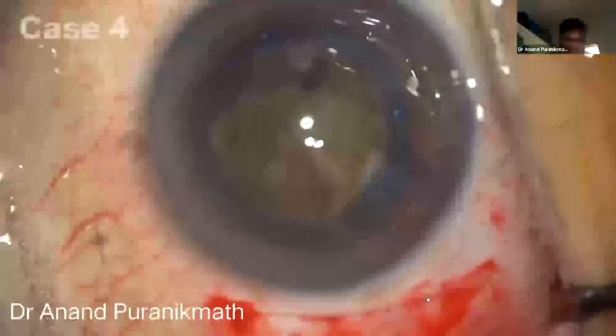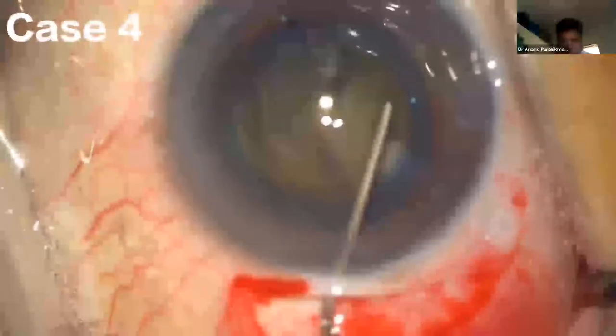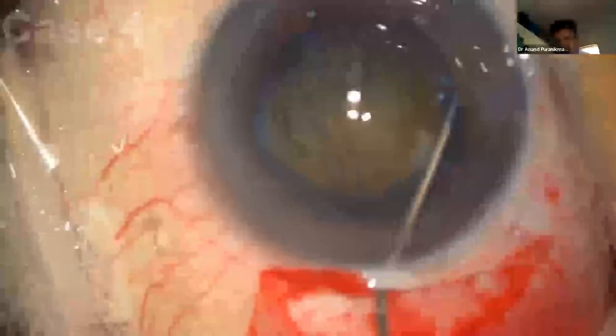This is the last case, where you can see the rhexis is around 6 millimeters, and the nucleus is quite hard, around grade 5 NS. Usually if we use two instruments, or if you use only the dialer to prolapse the nucleus, it sometimes becomes very difficult, and sometimes the capsular margin may also get damaged. But here you can see it is very easy.